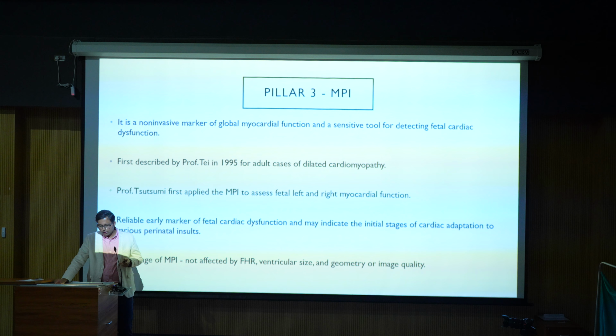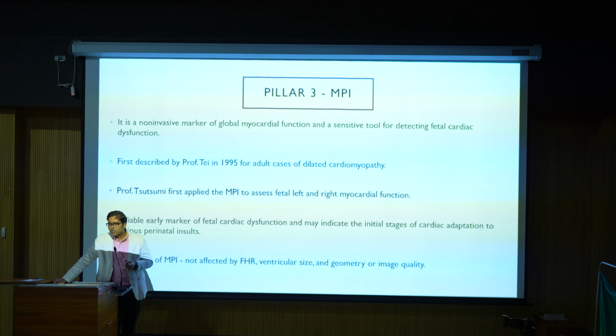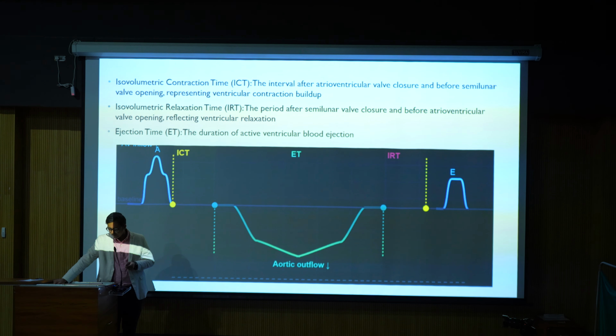It's a reliable early marker of fetal cardiac dysfunction and may indicate the initial stages of cardiac adaptation to various perinatal insults. The advantage of MPI is that it is not affected by fetal heart rate, ventricular size or geometry, or image quality. So this is very important.